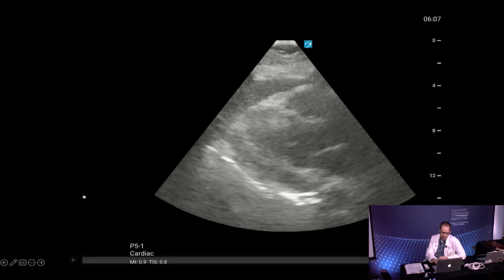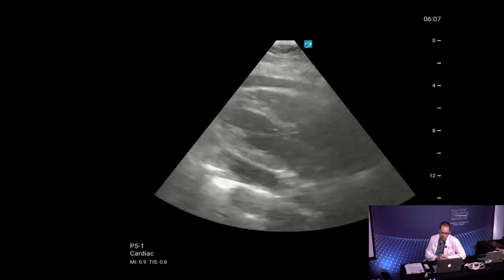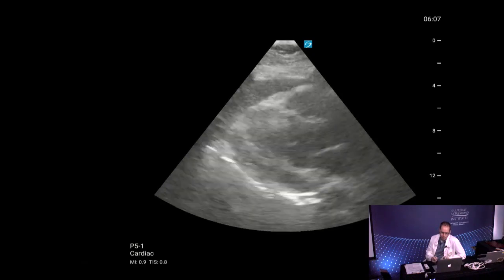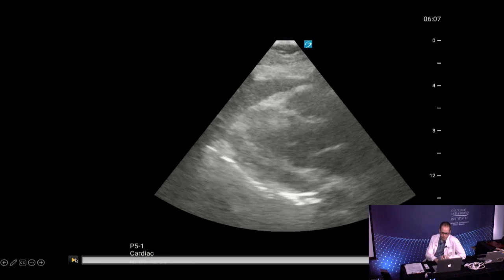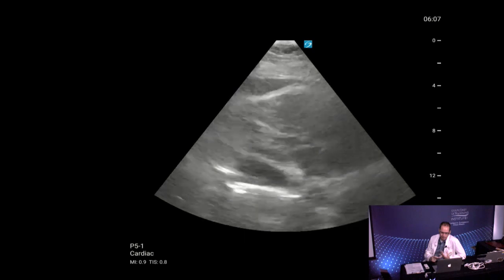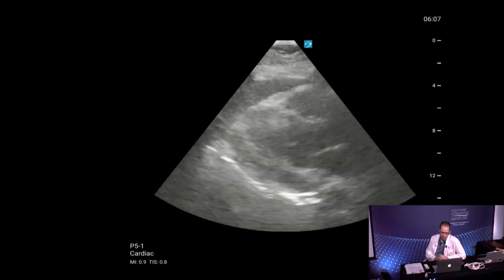But these are the reasons that we do ultrasound in critical patients. Right away, we'll identify what's causing her to be so shocky and hypotensive. Right away, we know we need to do an actionable intervention to save her life, and we can move on and go deal with other things, deal with the rest of the department.